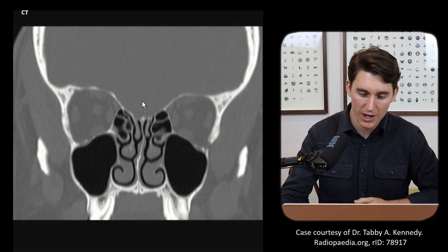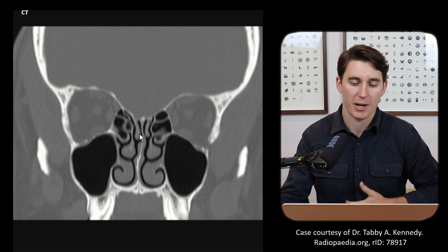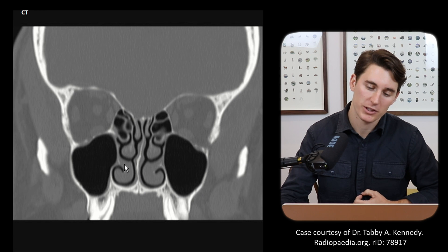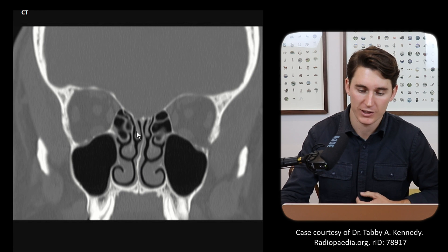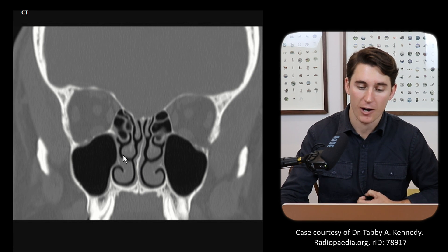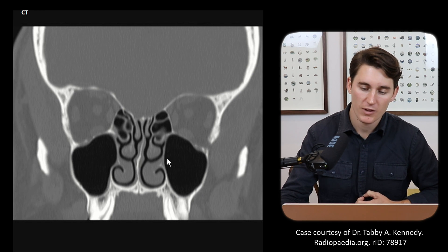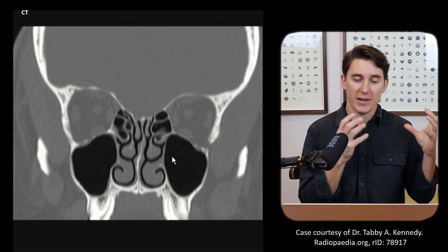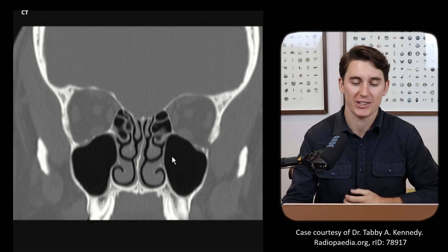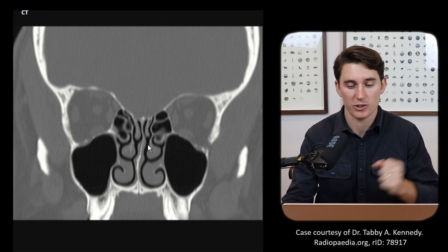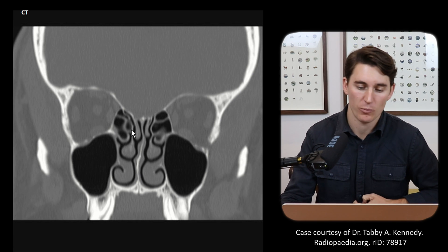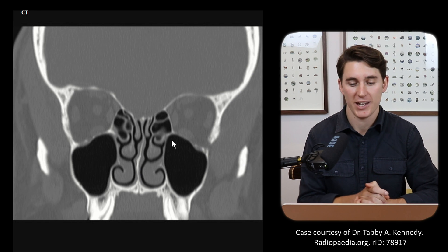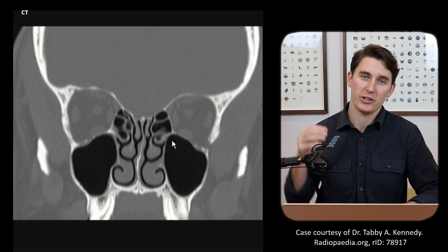We can see that there are three turbinates on each side of the nasal cavity: our superior turbinate, our middle turbinate, and our inferior turbinate. The aerated space lateral to those turbinates is known as a meatus — our superior meatus, middle meatus, and inferior meatus. The sinuses drain into specific meatuses: the frontal sinus and maxillary sinus, as well as the anterior portion of the ethmoidal sinuses, drain into the middle meatus. The sphenoid sinus and posterior ethmoidal cells drain into the superior meatus — that's how we differentiate anterior and posterior ethmoidal sinuses by where they drain.